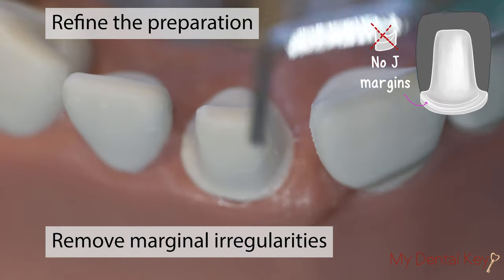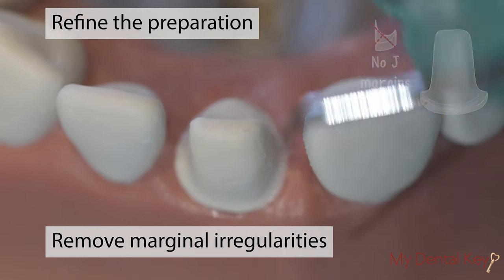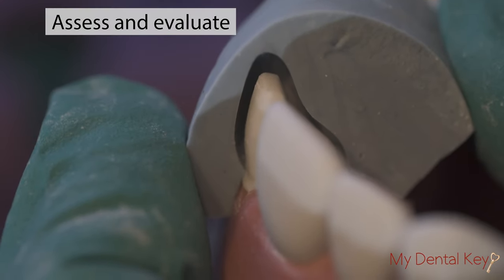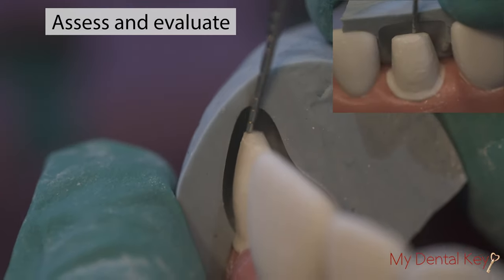Remove J margins using rotary instrumentation or hand instruments as necessary. Hand instrument options include the bin angle chisel or enamel hatchet. Ensure proper reduction by comparing against the reduction guides and using your probe to measure.